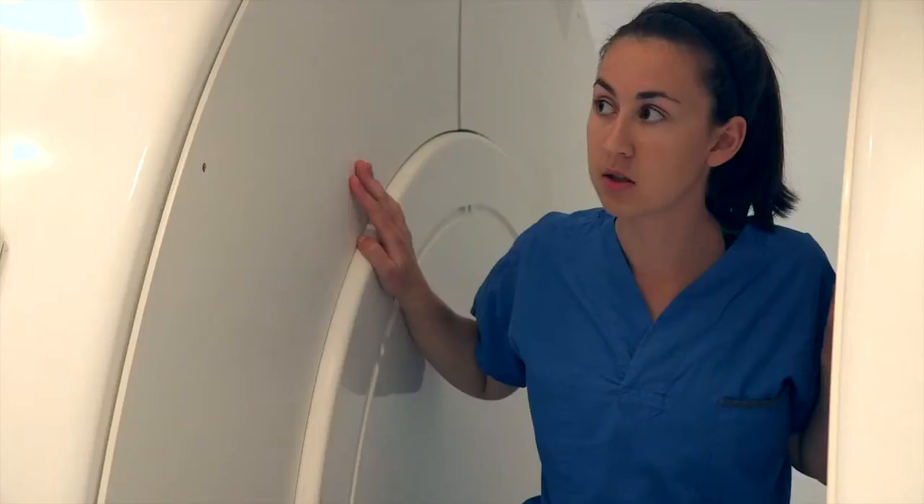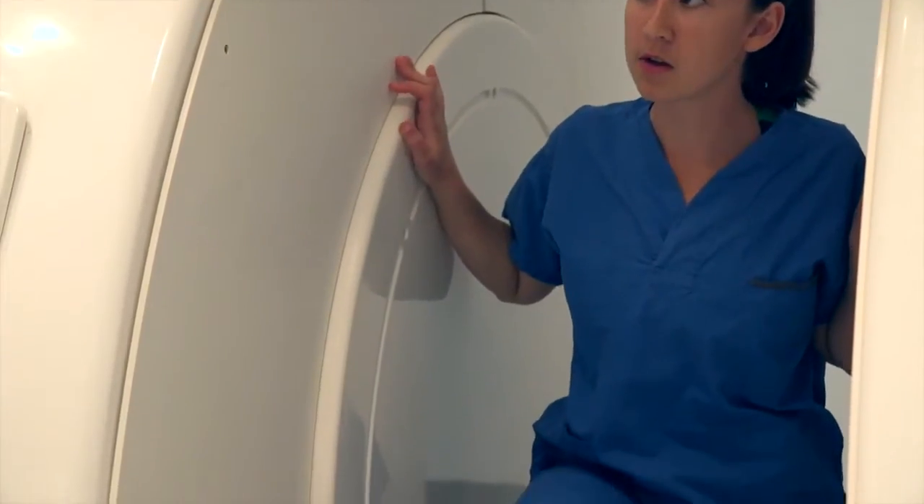I want you to start out facing straight forward, and then in your lunge I want you to do a rotation to the left so that you're facing the left hand side of the scanner.